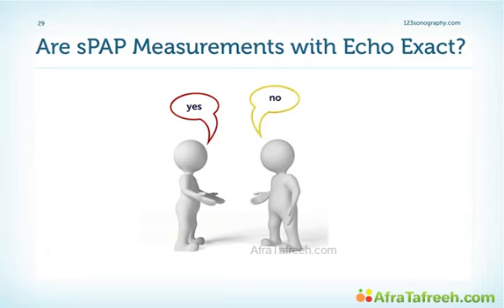But the question remains how accurate our SPAP measurements really are. Well, I guess this is a very controversial issue, as a matter of fact, and there are a number of studies which show that it really correlates quite nicely with cath studies, but then there are studies which show just the opposite. And one of the reasons for that is certainly the measuring of the signal itself. Yes, I think this is completely true, and there are a number of pitfalls involved in measuring pulmonary artery pressure. But this will be the topic of the second part of this chapter.